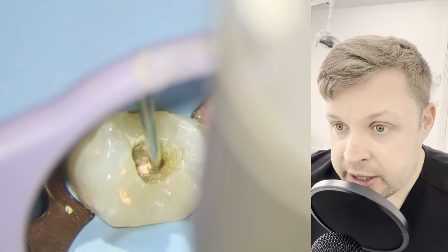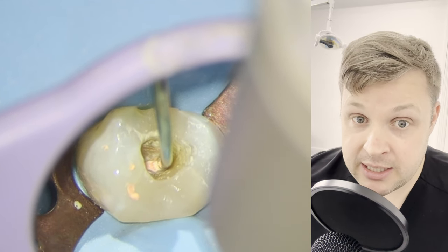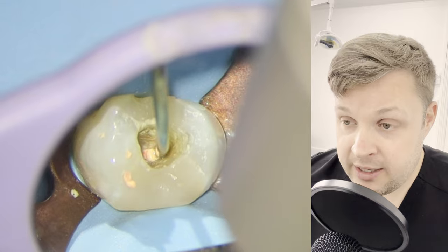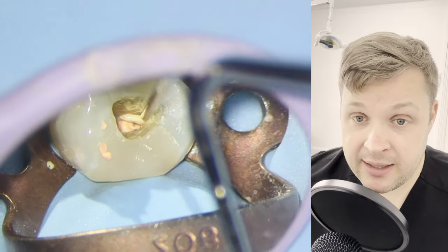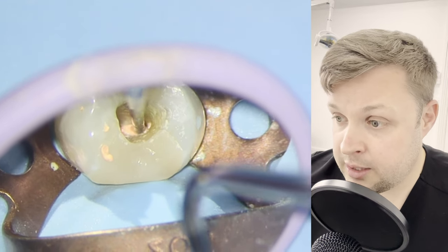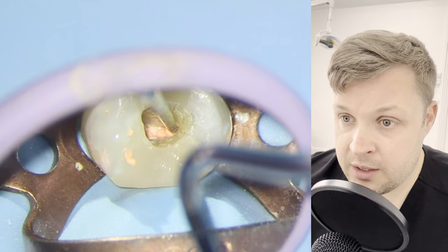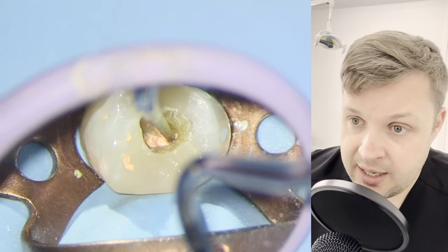If you're a budding endodontist, I don't always use the backfill, but when I need it I really, really need it. So don't be scared about buying something like this — it comes in really handy every now and again. Just giving a good old compact down with the MAK2 pluggers. Don't be scared — get in there and give it a good push.